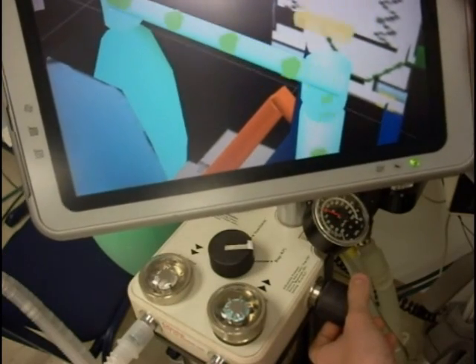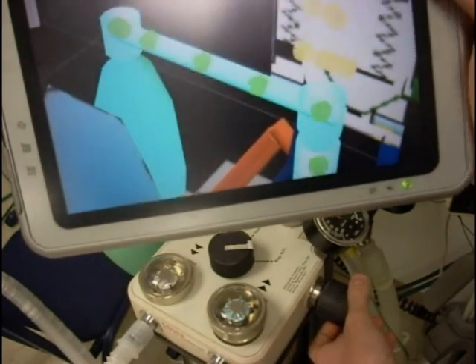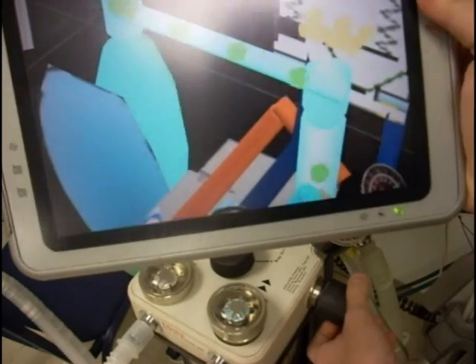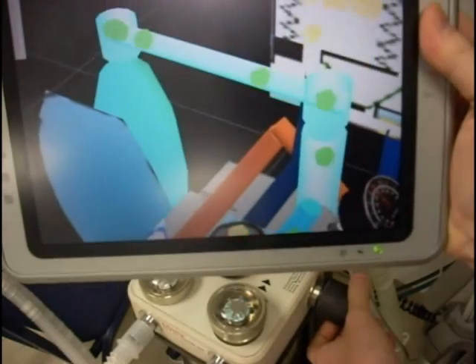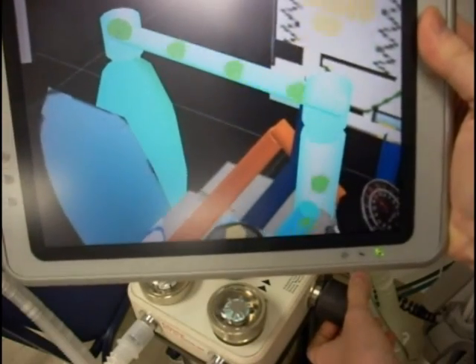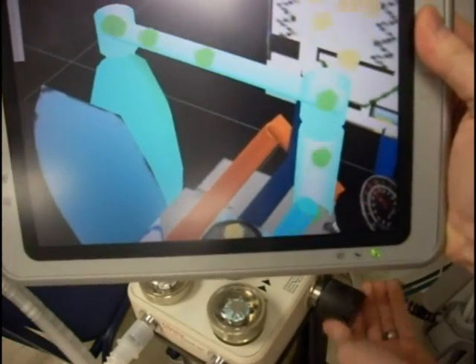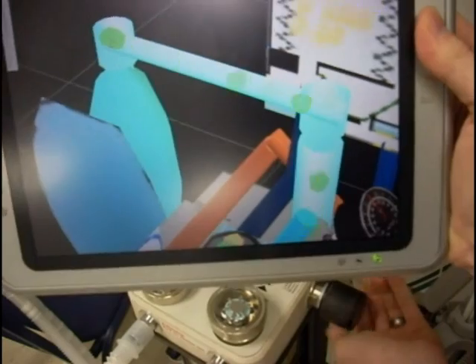Here the user turns the APL valve. This releases pressure in the bag and in the lungs.